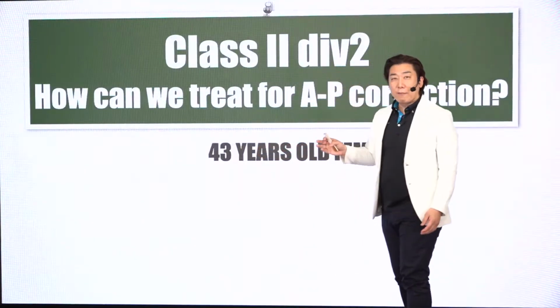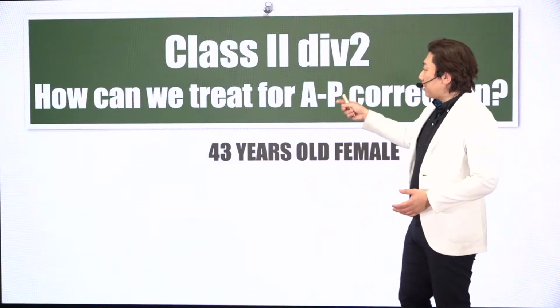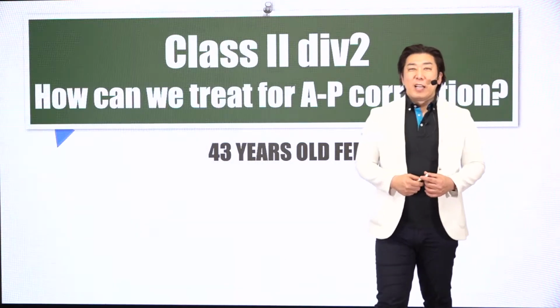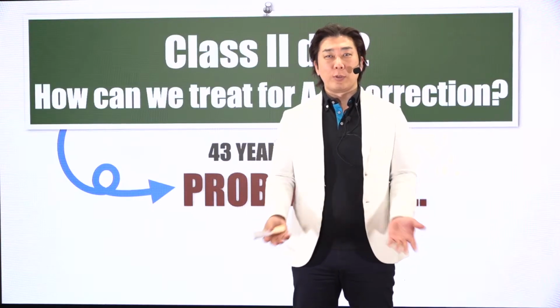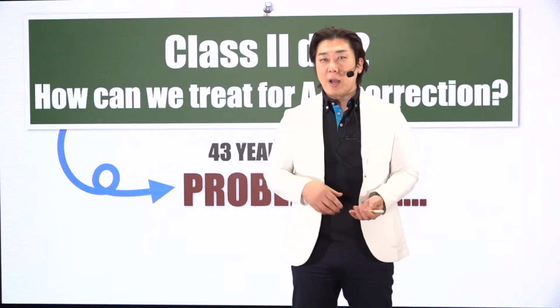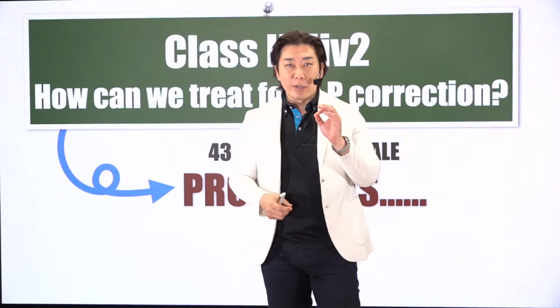This patient is a 43-year-old female. The chief complaint is, how can we treat this patient, AP correction, right? With the Invisalign system, aligner treatment, many doctors, many patients, many orthodontists think it is only a very simple case. So close, just a little bit, a simple case, a simple crowding.